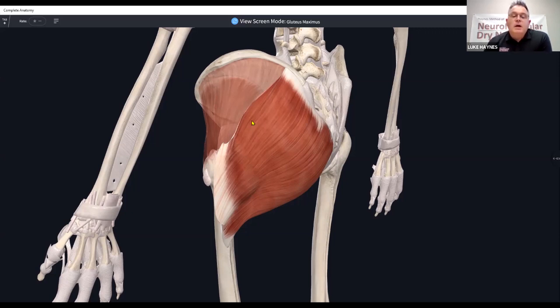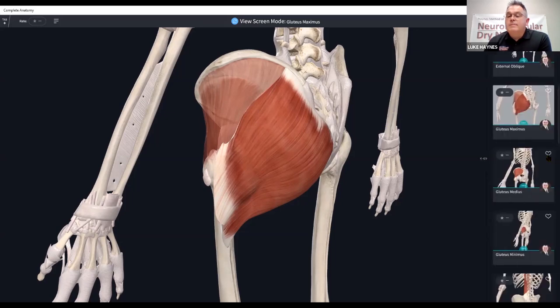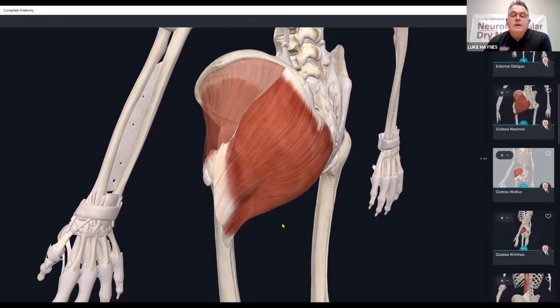That seems to get very good response out of that location right there. So if I have a lot of things going on and I have a patient that's phobic or apprehensive about needling, if I only get one needle, I'm going to drop that needle right there and get a really good response from that. So let's move from Gluteus Maximus to Medius.